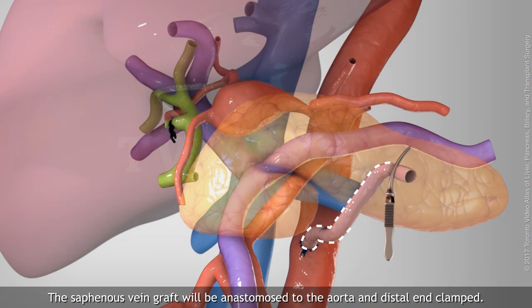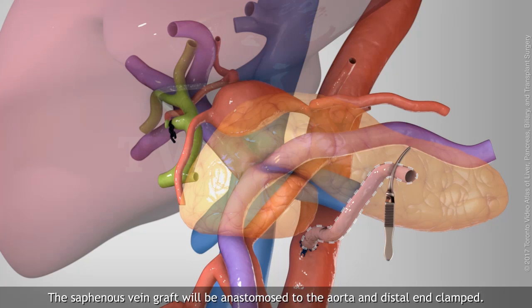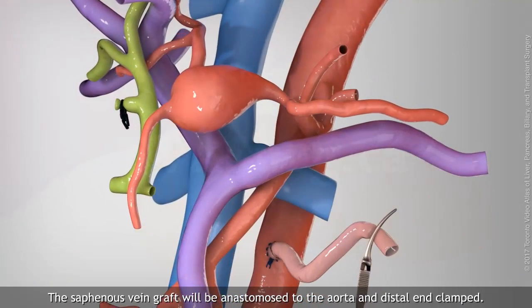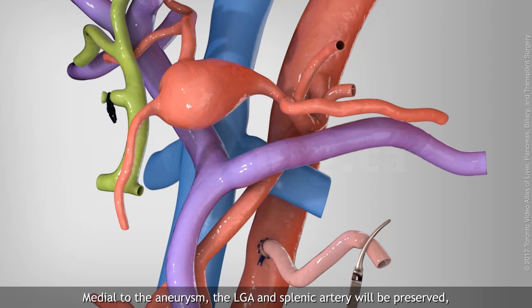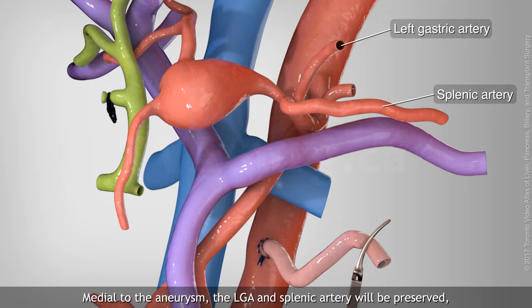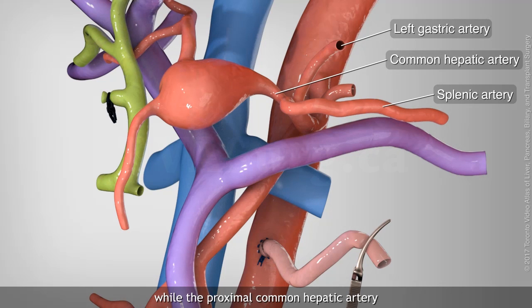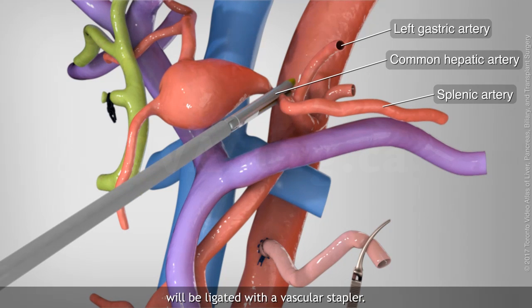The saphenous vein graft will be anastomosed to the aorta and the distal end clamped. Medial to the aneurysm, the left gastric artery and splenic artery will be preserved, while the proximal common hepatic artery will be ligated with a vascular stapler.